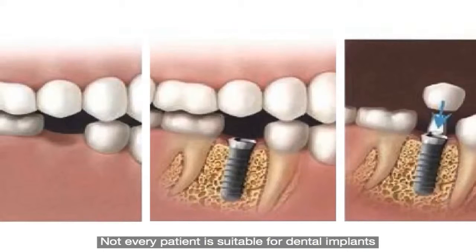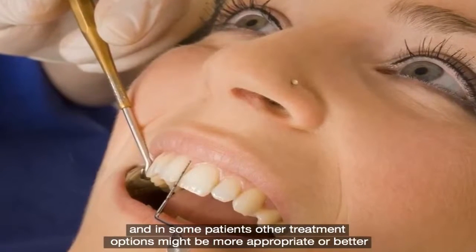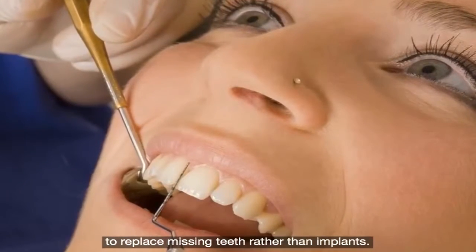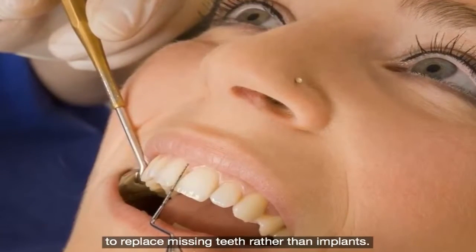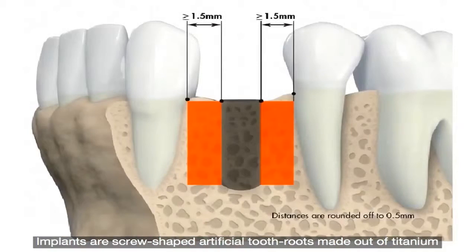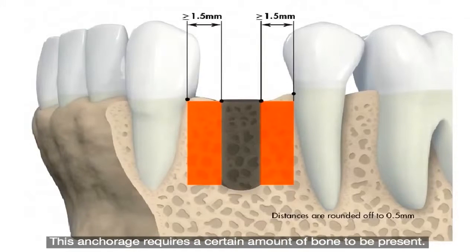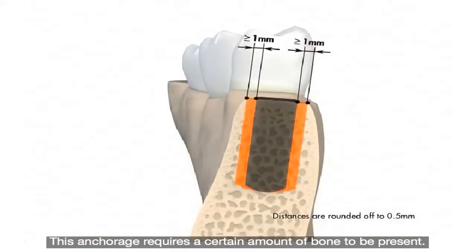Not every patient is suitable for dental implants, and in some patients other treatment options might be more appropriate to replace missing teeth rather than implants. Implants are screw-shaped artificial tooth roots made of titanium, which are anchored in the jawbone. This anchorage requires a certain amount of bone to be present.